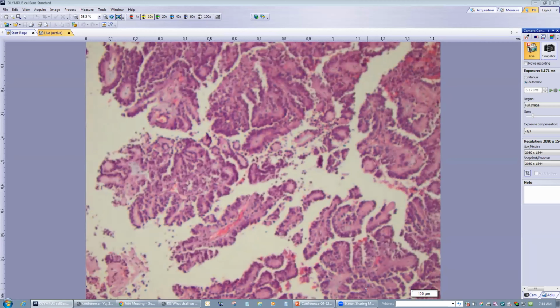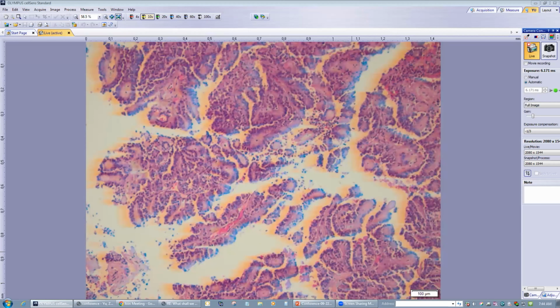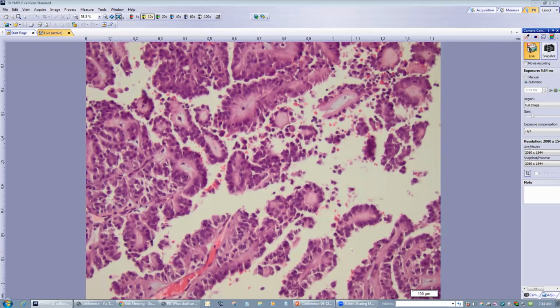So we ran a few immunostains. Because we thought it could be a solid pseudopapillary neoplasm of the pancreas, although the clinical presentation does not look like that, we did beta catenin, and it was negative. This one is not a classic voluminous cytoplasm, but because there's a kidney mass, we made some differentials at that time.